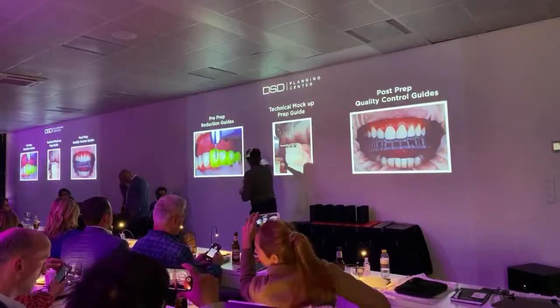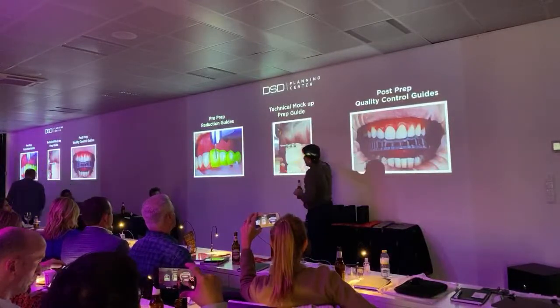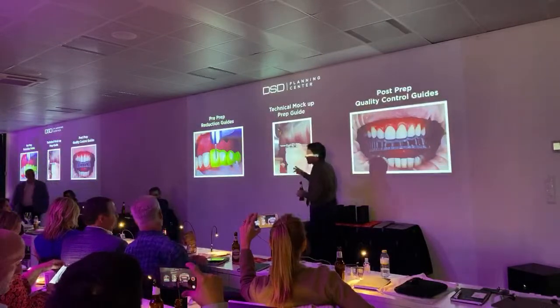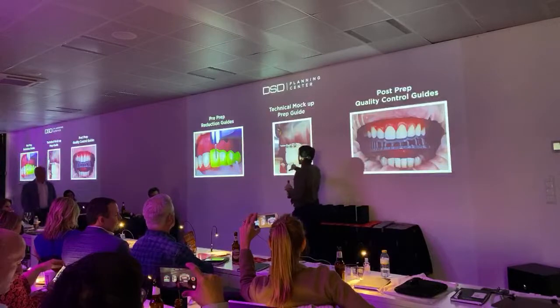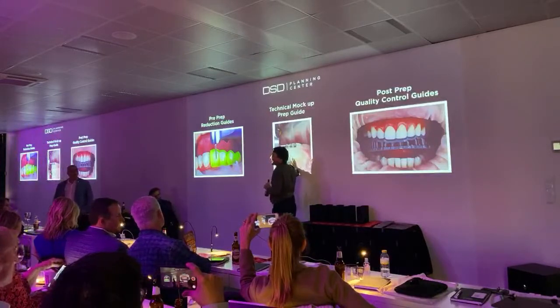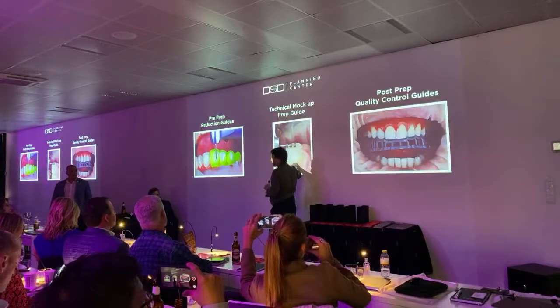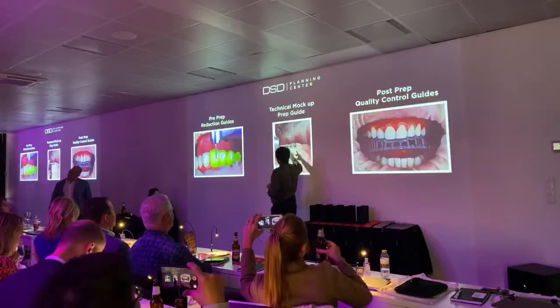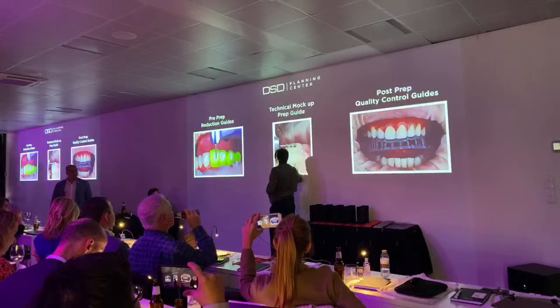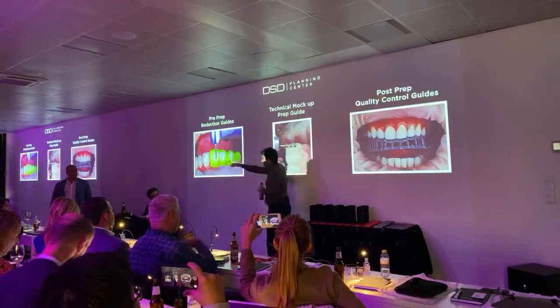If we follow this, you probably will never need that anymore. Okay? So this slide summarizes everything. The core of guided tooth preparation lies here. What is this? It is the actual technical mock-up, the ideal project. The ideal project goes into the mouth on the day of your tooth preparation, and you use the technique with the depth cutters to make the 3 grooves on the buccal and 3 grooves on the incisal, following this depth that comes as instruction from the lab.